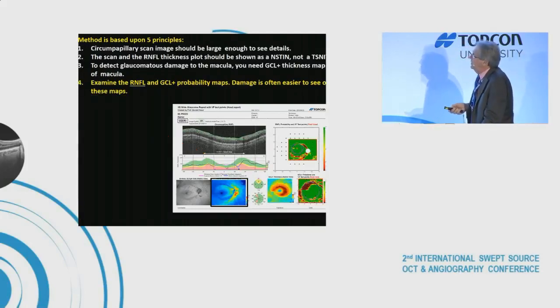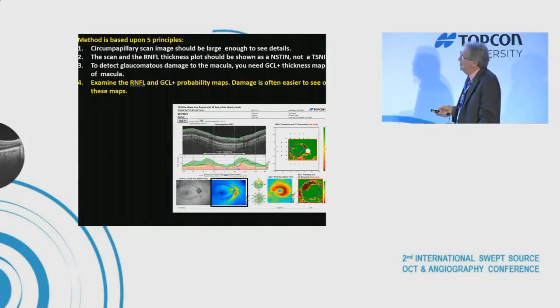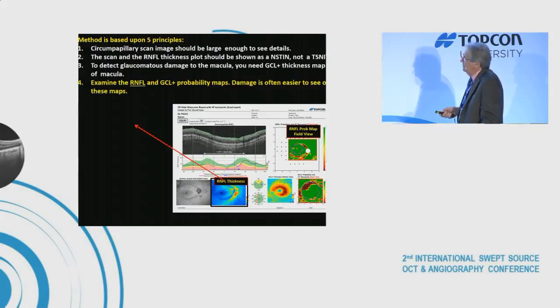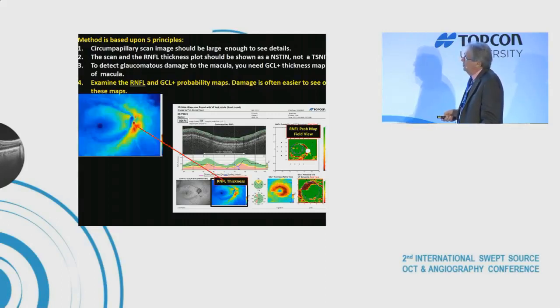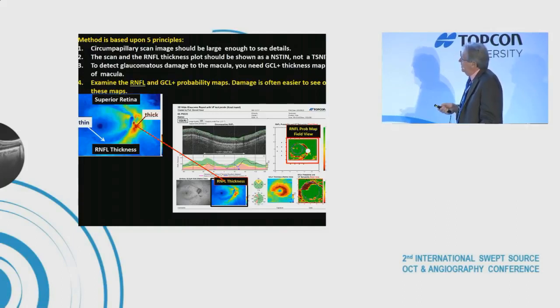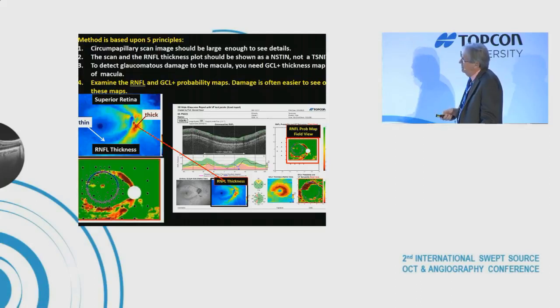We do the same for the retinal nerve fiber layer — taking the thickness map and turning it into a probability map. The map is flipped so inferior retina is correctly oriented, showing you where the significant thinning is: 0.1% versus within normal limits.